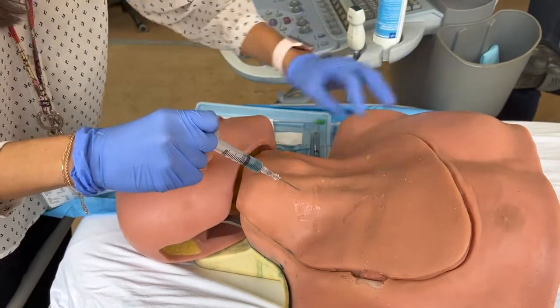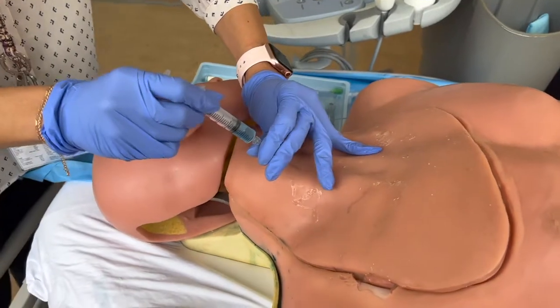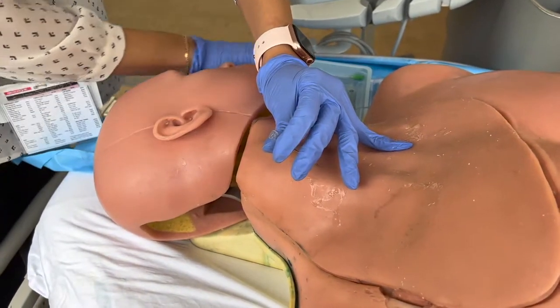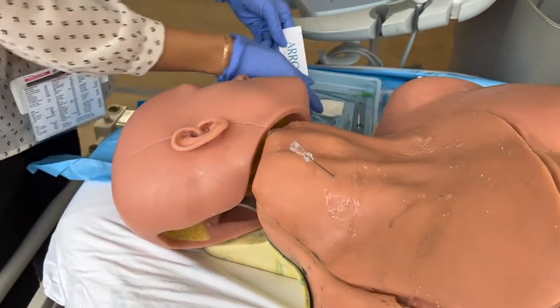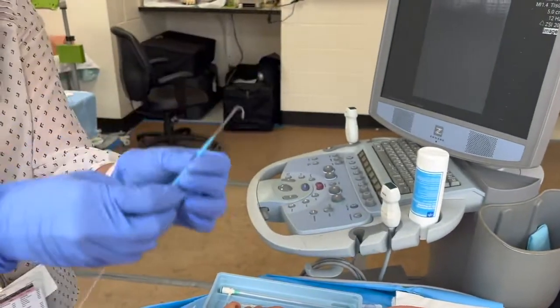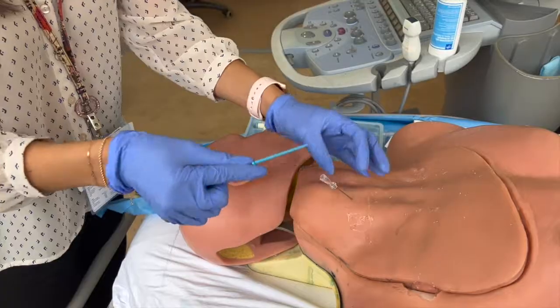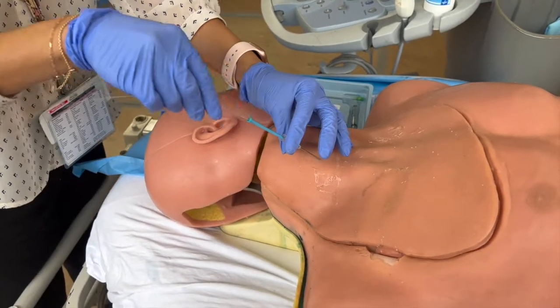So we have access. You stabilize your hand on the patient, grab the needle, remove the syringe. The wire that this one comes with — it looks like this, it's not great, it doesn't have the circle thing — but that's okay. I would keep this on it. So you just put this blue thing here and then push the guide wire in.